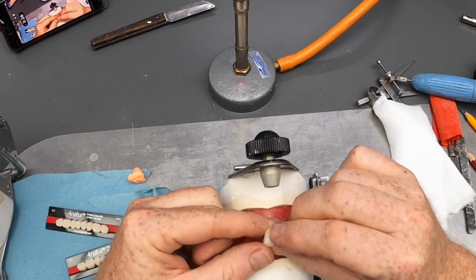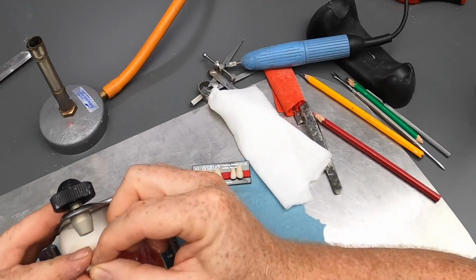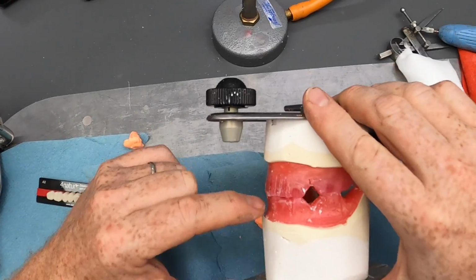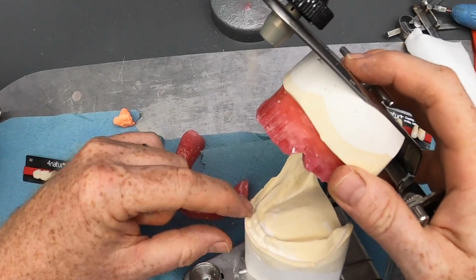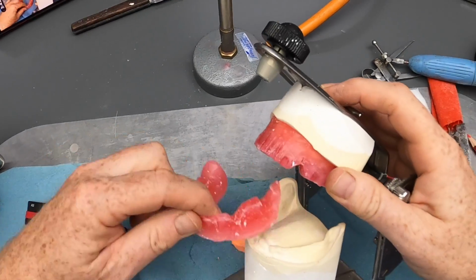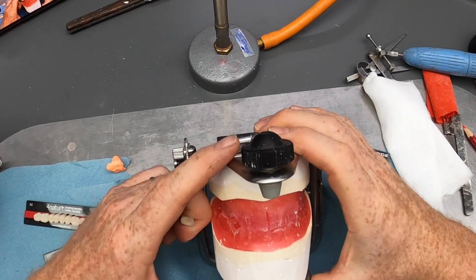Okay, so overall, when we're positioning teeth in the anterior region, we're just following the block. When we come to setting the lower anterior teeth, we're going to want them sitting directly over the alveolar ridge, and then we're going to want to create the relation between the upper and lower incisal edges when we go into the protrusive excursion.